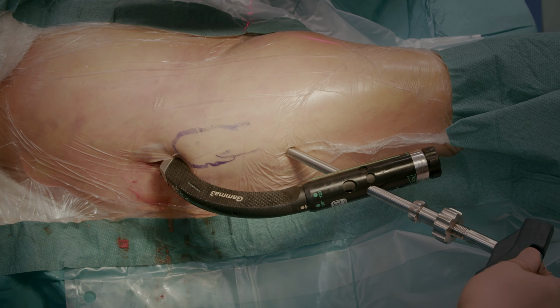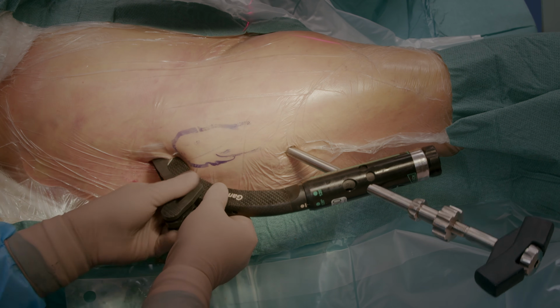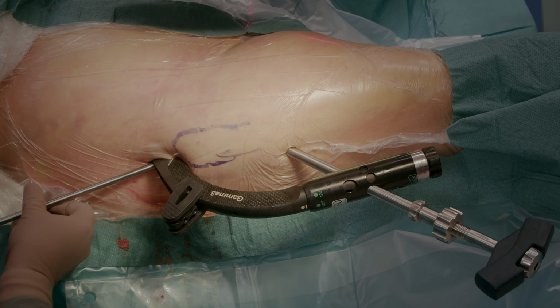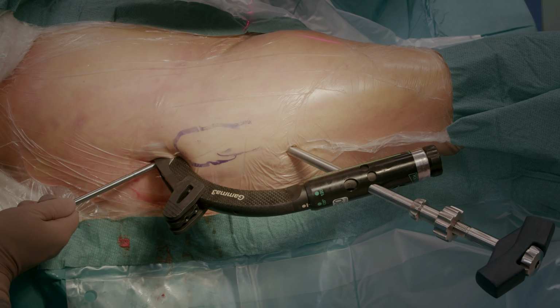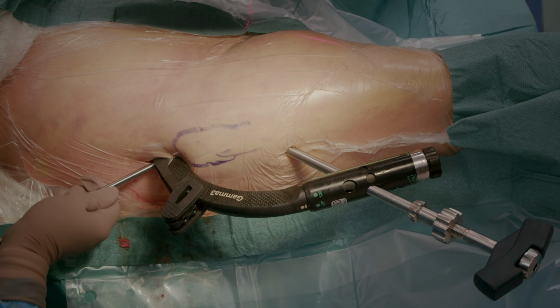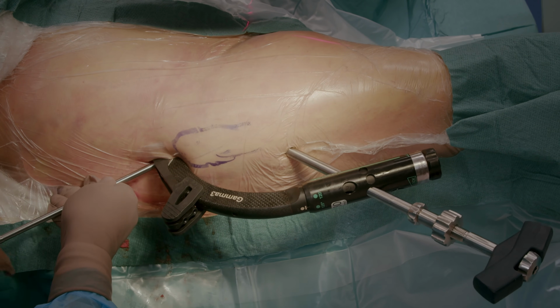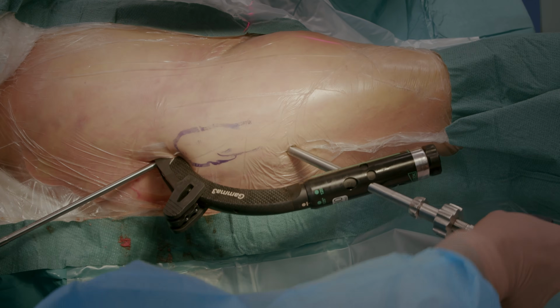Before removing the lag screw insertion device, you need to place the set screw, which is inserted from the proximal direction into the nail. For this purpose, this guide tool can be used, which I connect to the target device. Then, using a flexible tip screwdriver, we insert the set screw. We start turning the screw and tighten it fully and make sure there's no rotational movement here on the lag screw handle.